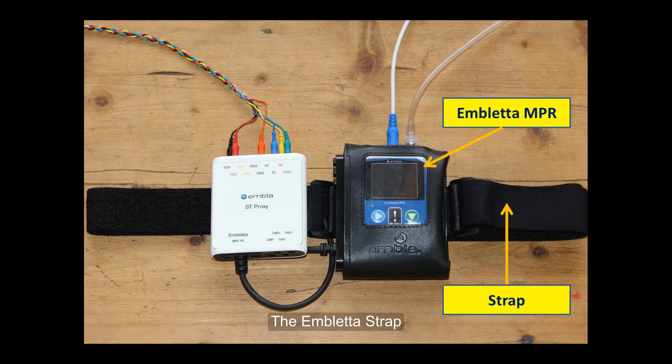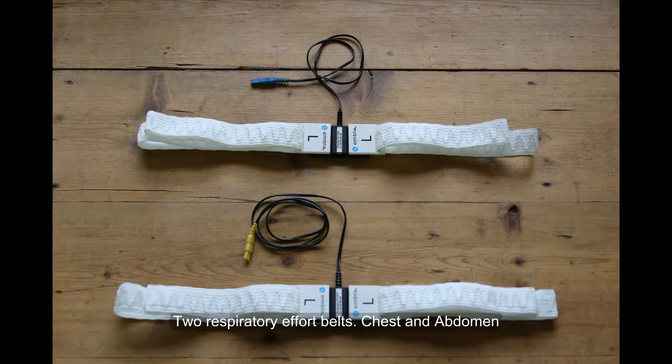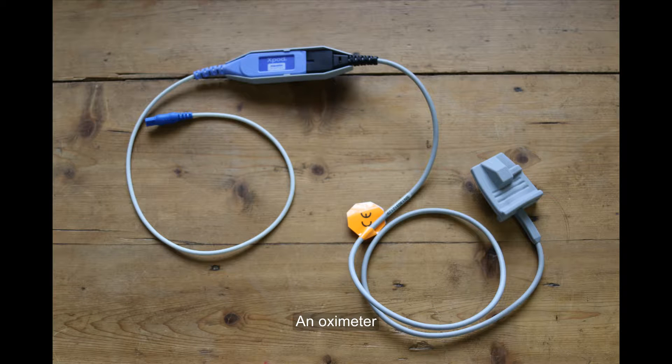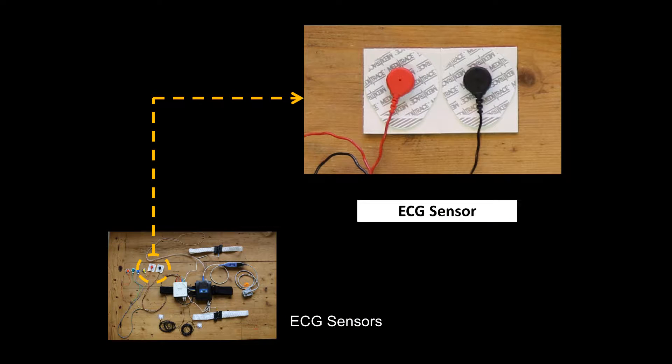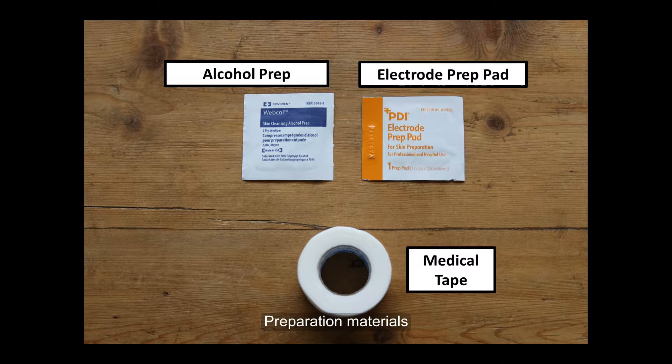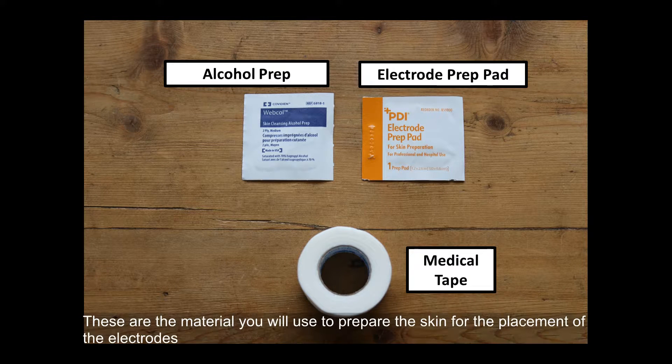The Ambleta straps, two respiratory effort belts — chest and abdominal — a nasal cannula, an oximeter, ECG sensors, four coloured electrodes for the head, and preparation materials. These are the materials you will use to prepare the skin for the placement of the electrodes.